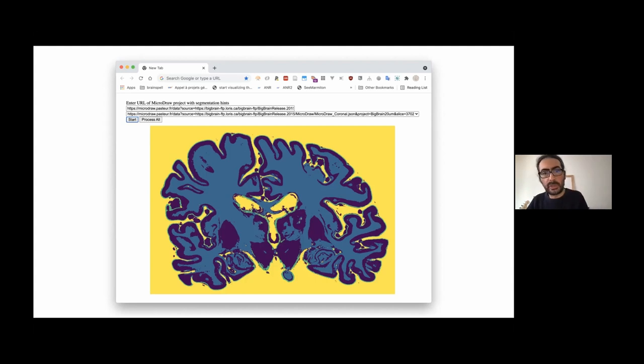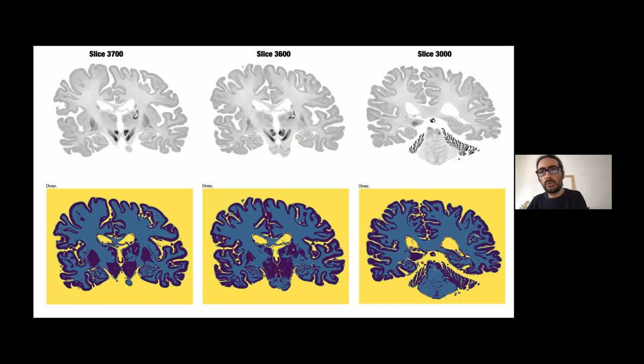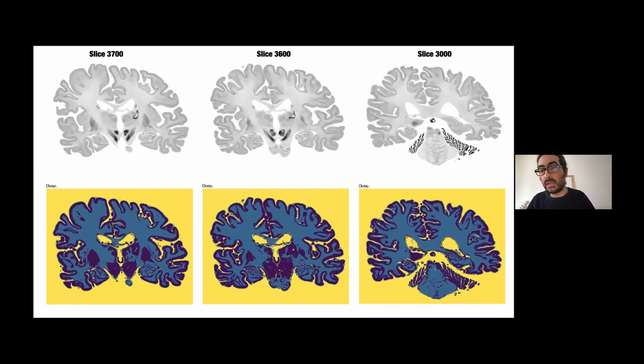This is for the slice where the segmenter was trained. So it's not surprising that it works not too bad. But here you can see for a slice that's pretty close, two slices down the road. But even 100 slices down the road or in slice 3000, the results are not too bad.